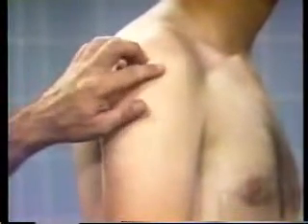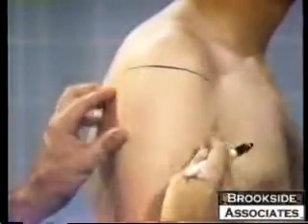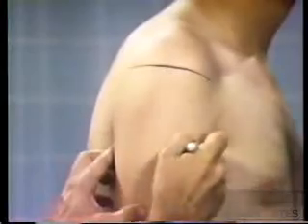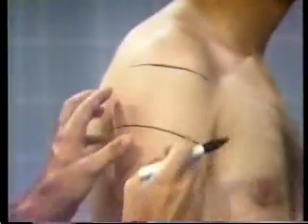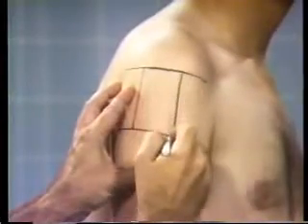We'll now show you the area on a patient. The deltoid region is bordered on the top by the lower edge of the acromion process. On the bottom, by a line drawn from the folds of the axilla. Side limits are the middle third of the deltoid region.